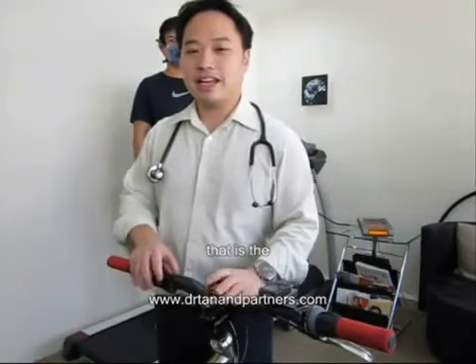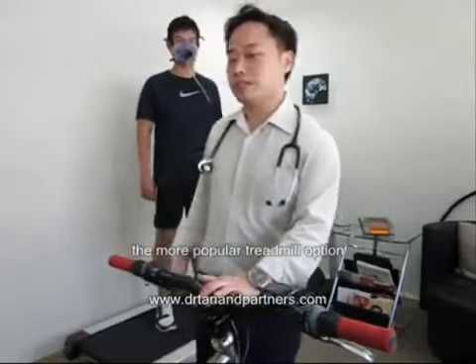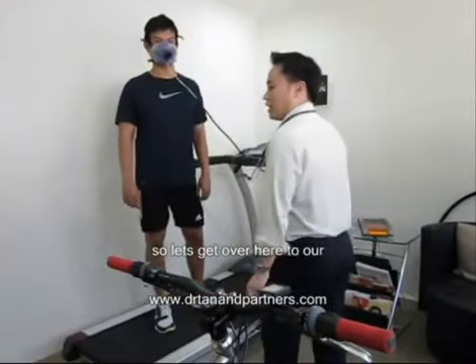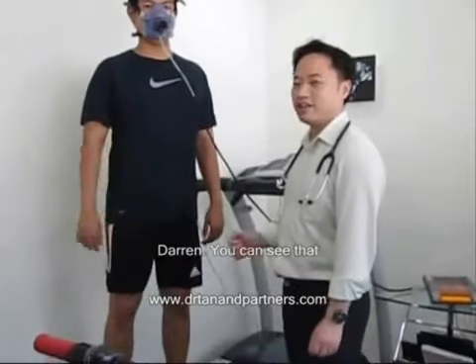We have two options on measuring VO2 max at our lab — that is the bike or the more popular treadmill option. Let's introduce our test subject for today, who is our sports and fitness expert, Darren.